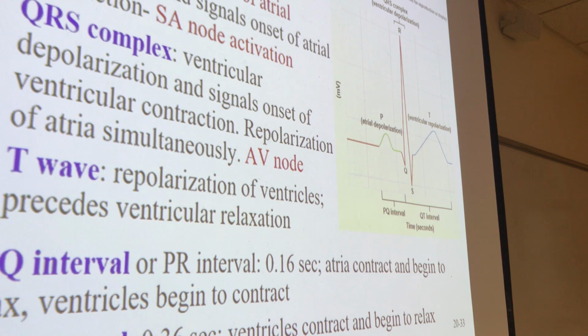EKG and ECG are the same. In America, we call it ECG, electrocardiogram. The C is for cardio, right? In Europe, they use the K for cardiogram. It's identical though. We're still talking about the same waveforms, and the same exact meaning for those waveforms.